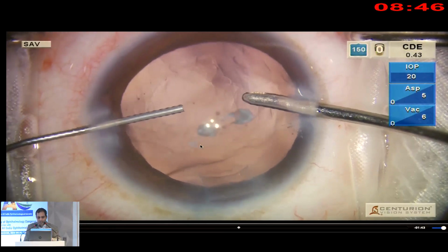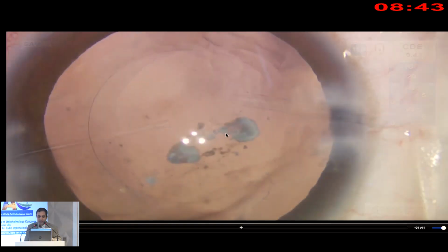So fortunately, having followed all the principles, now we are in this situation with this pre-existing tear, which has not extended, and there is also significant plaque and some, as you can see, particles in the anterior vitreous phase. Now this patient also had very high astigmatism. So we had explained to her that if we are able to preserve the bag and preserve the posterior capsule, we may consider doing a toric IOL, but otherwise we'll go ahead with a 3-piece monofocal IOL.